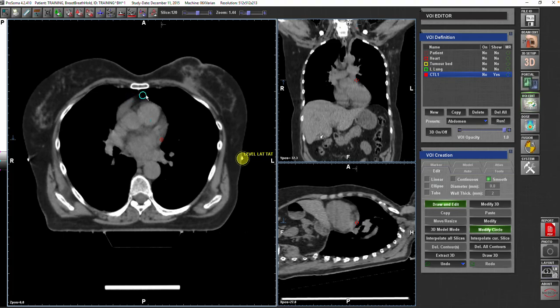The internal mammary artery is coming from the subclavian artery again. So look how important it is to familiarize yourself with the subclavian artery. Not only this, if you are working in head and neck, the subclavian artery will give you the thyrocervical trunk, which is part of level 5 when we go for the neck node leveling. So knowing the subclavian artery, or familiarizing yourself with it, I would highly recommend it.